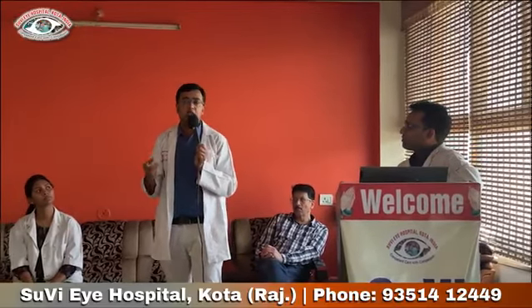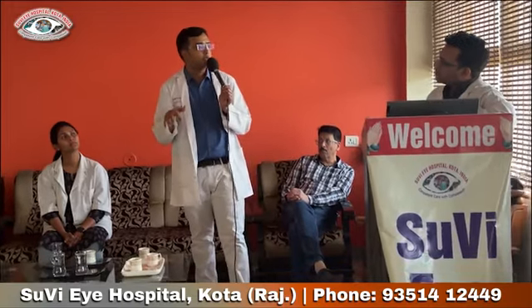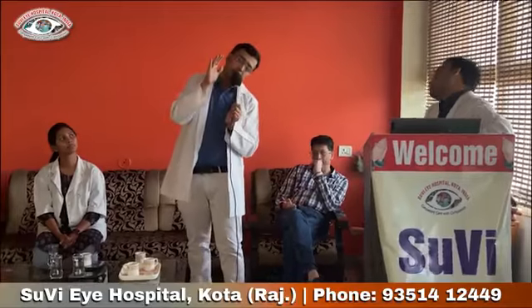In another study they mentioned that one assistant holds the lid apart, while wearing protective goggles, and we do the barrage laser. Some people prefer the superior-temporal border, with the patient's head tilted like this, and we do the barrage laser. So all these maneuvers have also been reported.